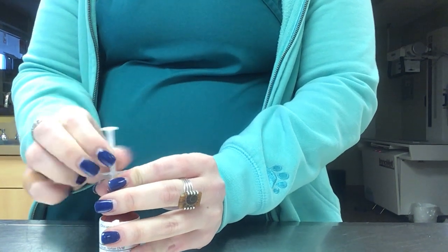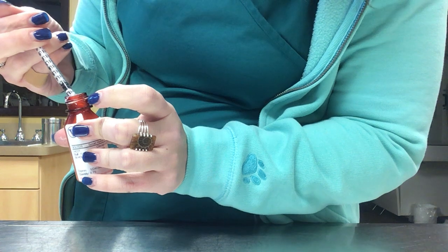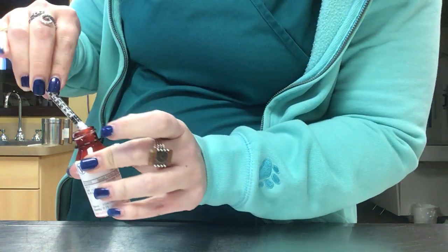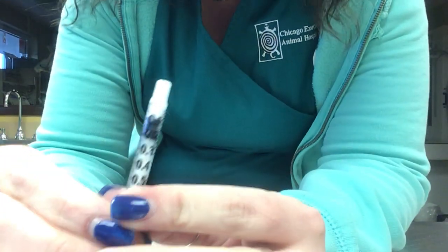Pull up more than you need and look down at your syringe, then push it out until you get to the exact dose, which is 0.09 for the enrofloxacin.